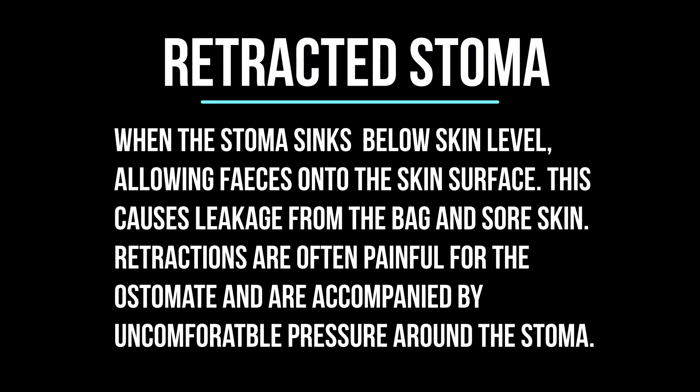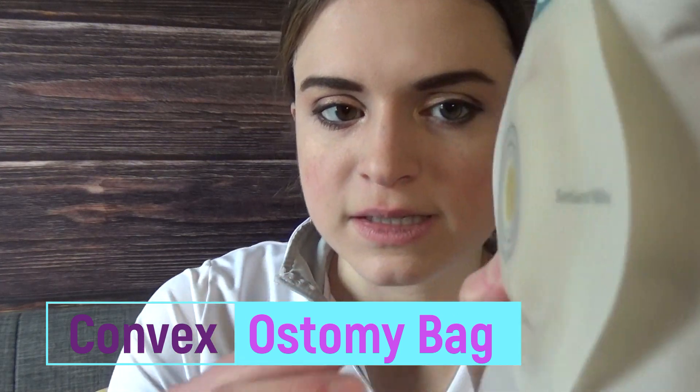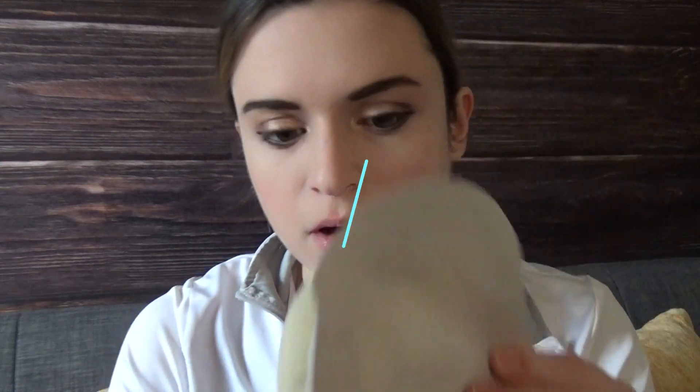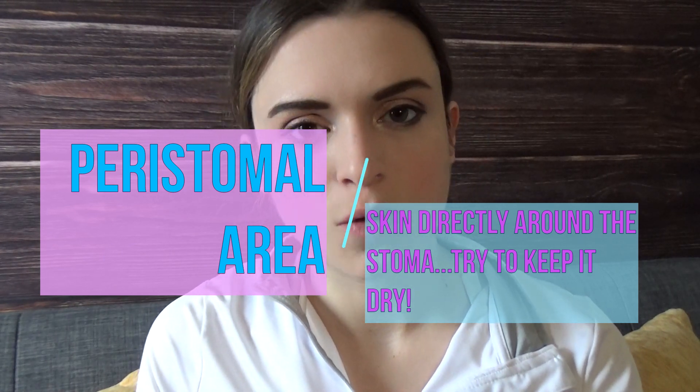This is a Coloplast Sensura Mio convex bag. A convex bag means that the wafer has a little divot that makes it stick more to the skin — it has an extra layer of protection surrounding the peristomal area. When I say peristomal area, I mean the area of skin directly around the stoma.